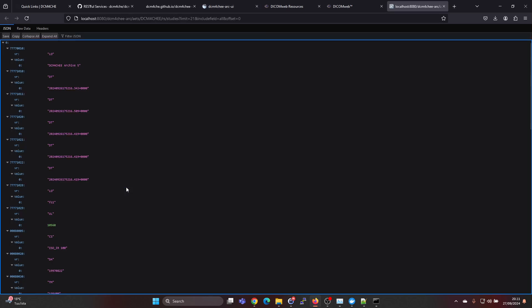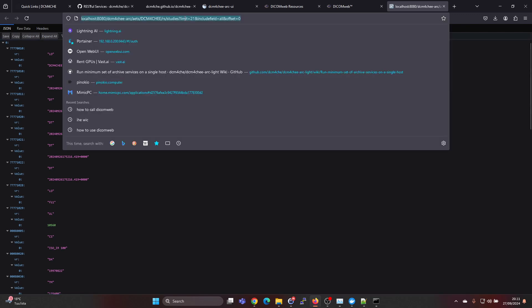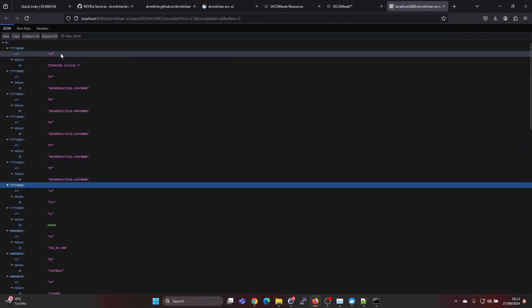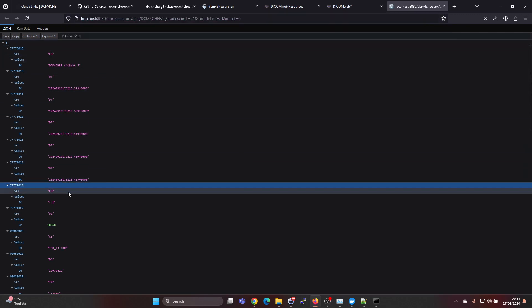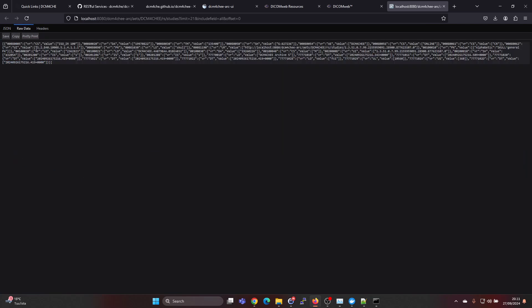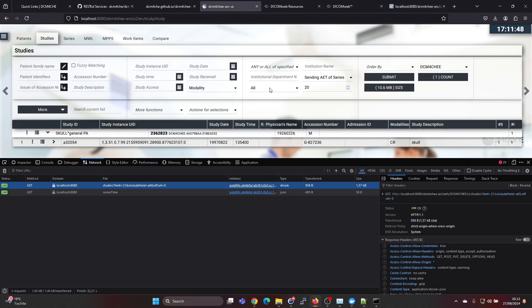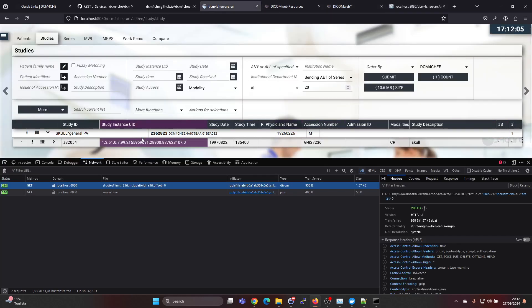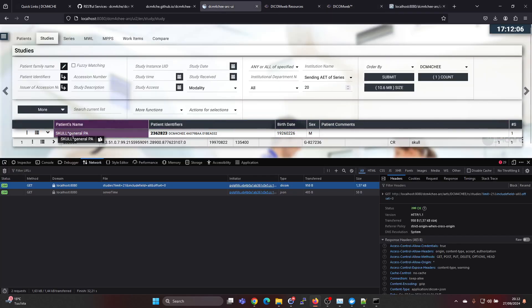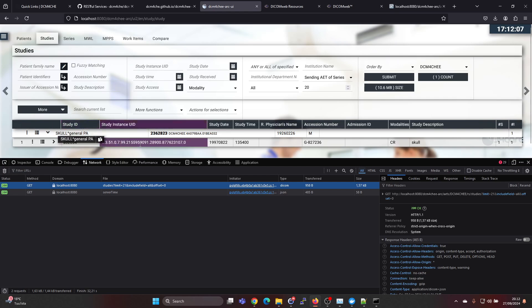If we double click here we can see it in the URL bar and we can see the response in the JSON object and also in this raw data format. Currently the Dicom archive has only one patient with one study.